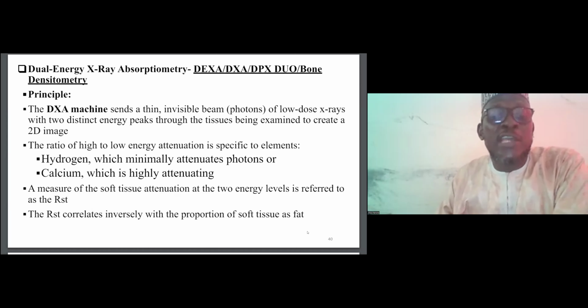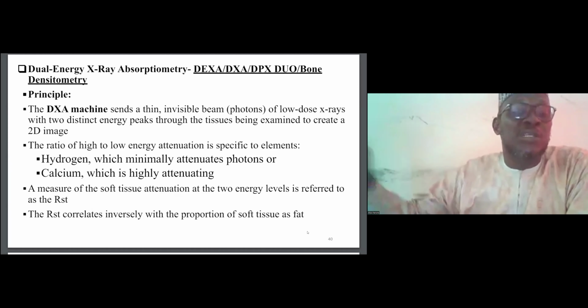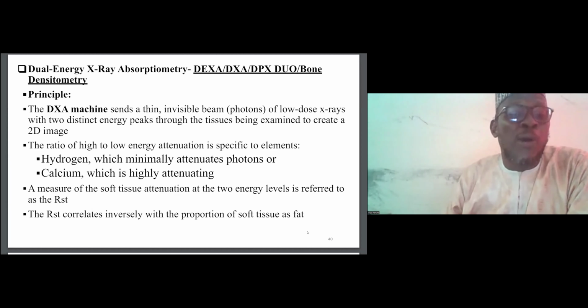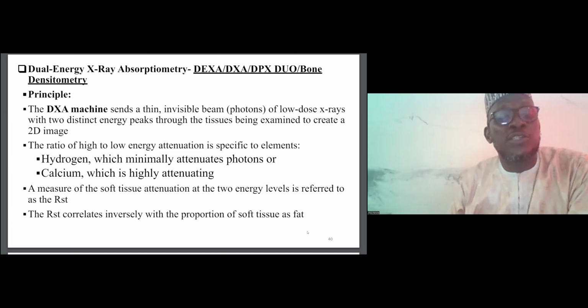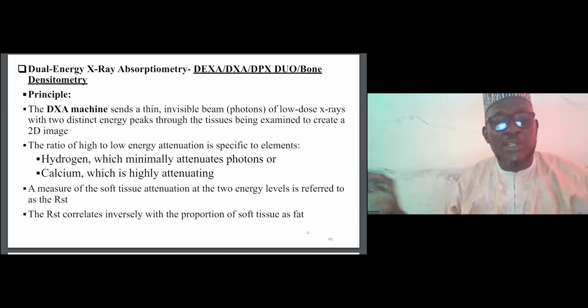What we know generally about X-ray machines is that what happens to photons when they are expanded from the tube head onto the tissue is either they get absorbed by the density of the tissue concerned, or they penetrate completely to the detectors, like the conventional X-ray films. The last is they get scattered. That is, they have no penetrative power. They hit the density of the animal, the body surface, and they scatter. And those ones are the most dangerous within the X-ray workroom.